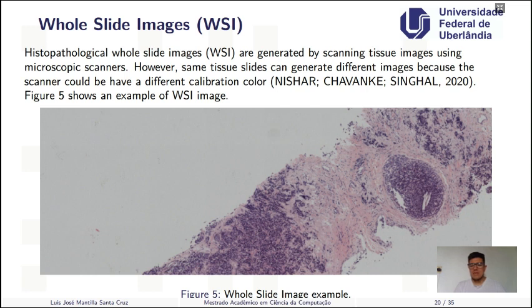Some of the paper authors told us about the possibility of generating many images using a single scanner and just varying the calibration color.